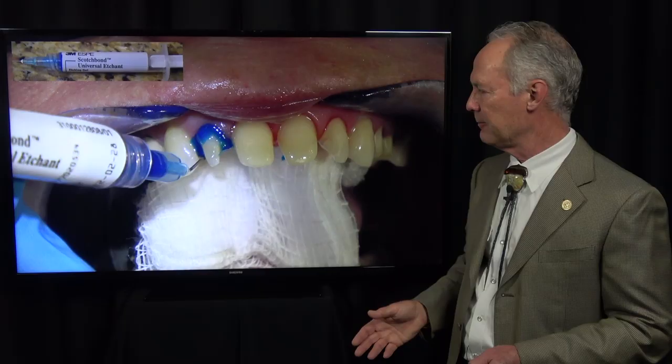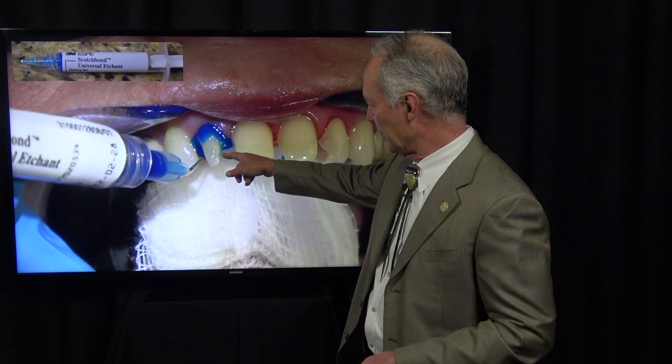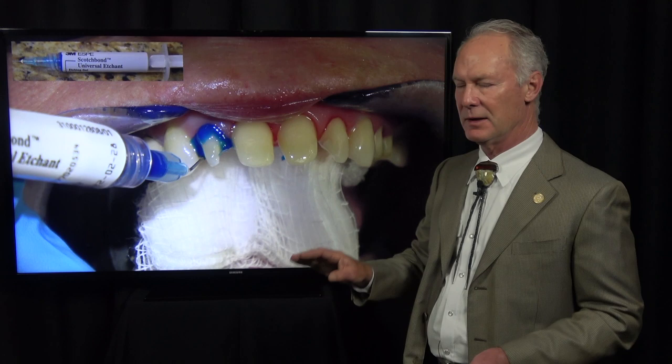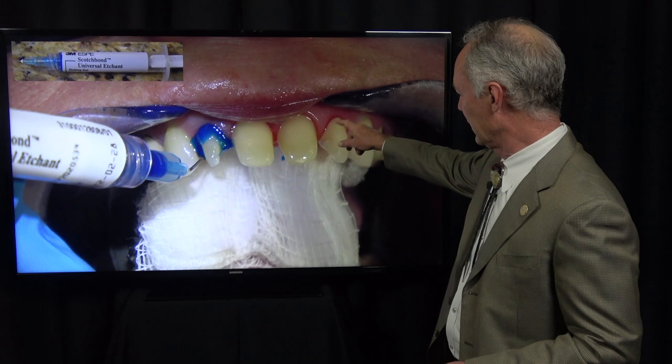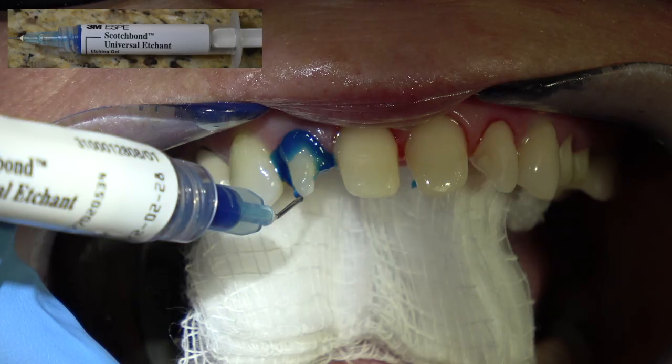I'm squirting this 38% phosphoric acid on the teeth. Now, this part has come off. I'm going to etch that too. And the phosphoric acid is an excellent hemostatic agent. So if you squirt that on any area, gingival areas that are bleeding, it's fantastic for hemostasis. But be sure when you rinse it off, use ice cold water in a plastic water bottle with a large tip. Don't use your air water syringe or you'll cause bleeding.